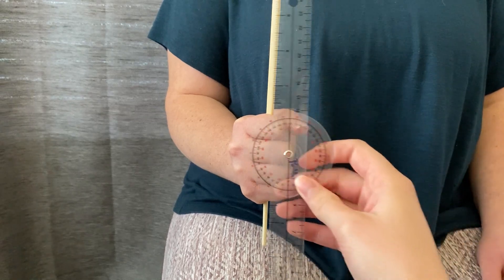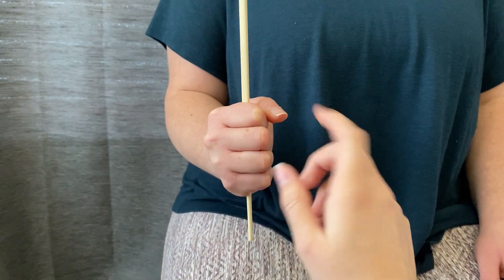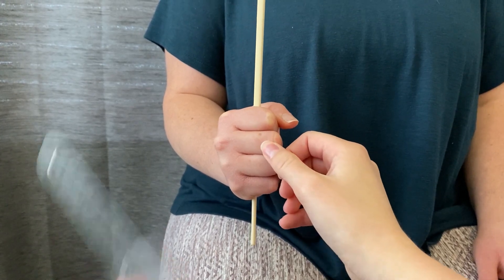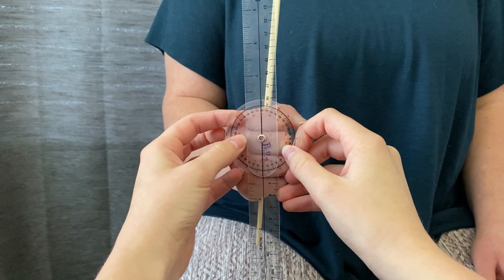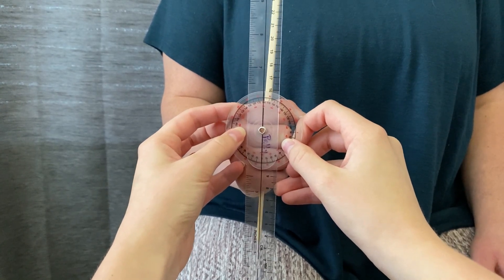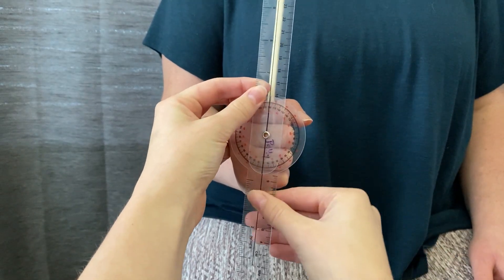The goniometer is going to start open. The axis placement is going to be centered between the MCP joint and the PIP joint of the middle finger, right here. The stationary arm is going to be perpendicular to the floor, and the movable arm starts pointing at the ceiling and will follow the object as it goes into supination.